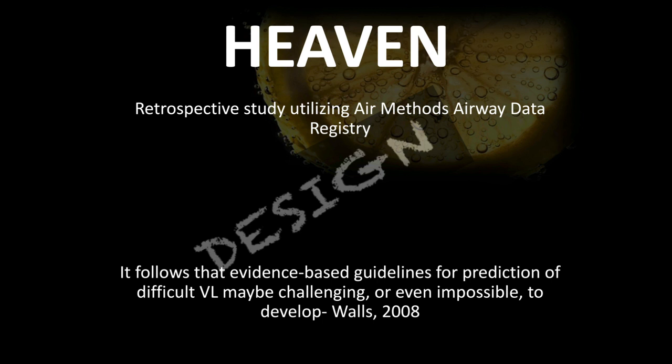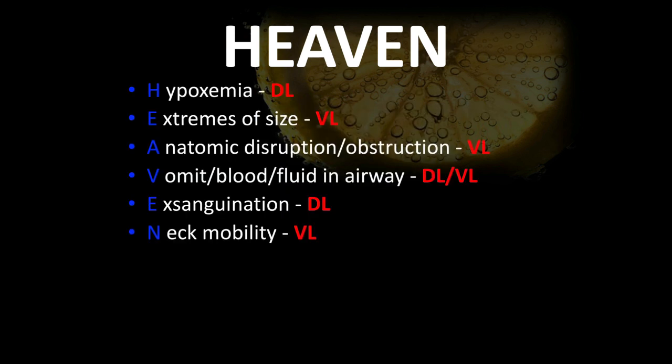And so really that was the thought process, as they had employed the CMAC laryngoscope devices. And really the training was focused on what is the best approach? Is it VL, video, or DL, what we'd used for years and years and years? And can we evaluate how our providers are managing these patients? What's the best way to reduce our first pass failure rate? And so the design really was focused on looking at all these data points, and there was over 200 data points that was evaluated constantly.